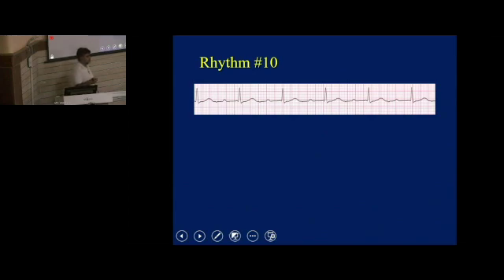So how much? 300 by 5, about 60. Roughly 60, or maybe lesser than 60, because it is slightly more than 5. Rhythm is regular. Is it sinus rhythm? There is a normal P wave followed by QRS complex, P wave followed by QRS complex, upright normal P wave followed by QRS. So we say that this is sinus rhythm.